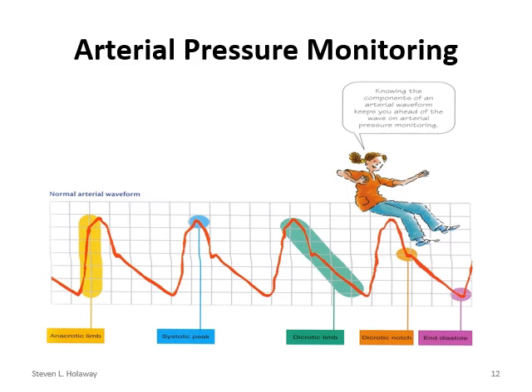Now, when we have a patient that has an arterial line in place, we're going to see a numeric representation of the blood pressure on the monitor, and then we're going to see a waveform. The waveform is important so that we can tell how well we're getting readings back from that arterial line. The arterial waveform should have a very swift upward movement, kind of peak, come back down, and have a little bit of an arch called the dicrotic notch. You can see it a little bit better here, and that's just closing the valves.